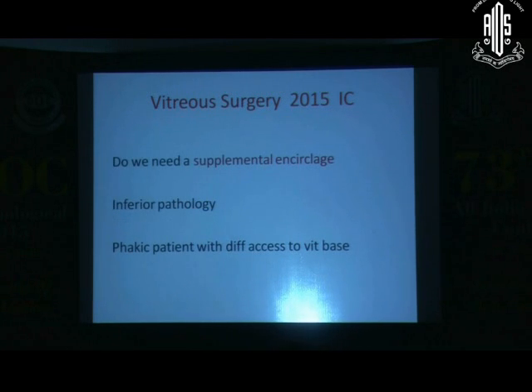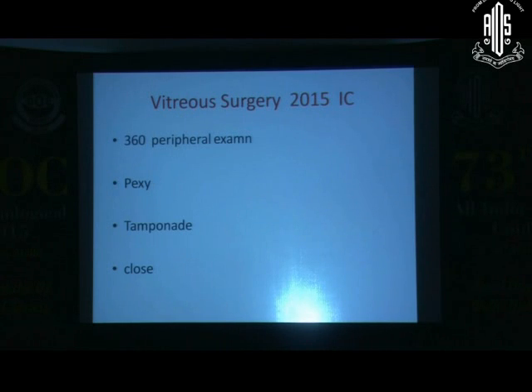To tackle this traction, we should also remember the help of a supplemental encirclage if needed, especially in cases of inferior pathologies and also in phakic patients where access to the vitreous base may be difficult. So we then proceed to the next steps of vitreous surgery. Thank you.